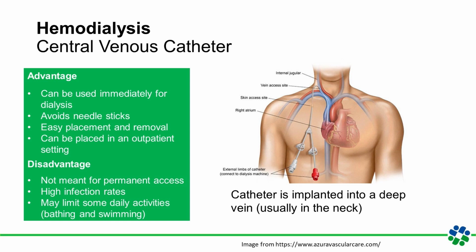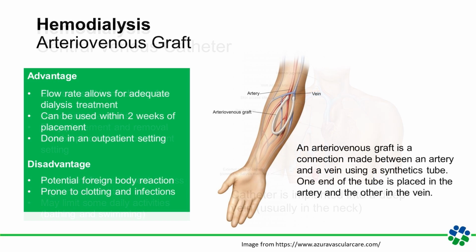Having a CVC also necessitates certain lifestyle adjustments. Daily activities that involve water, such as bathing and swimming, may be restricted to minimize the risk of infection. The CVC is typically placed in a large vein in your neck, providing easy and direct access to your bloodstream. And despite its challenges and risks in specific situations, especially when immediate dialysis is required, it's a vital and life-saving option. Well, how about arteriovenous grafts?